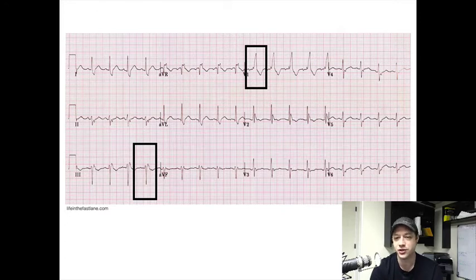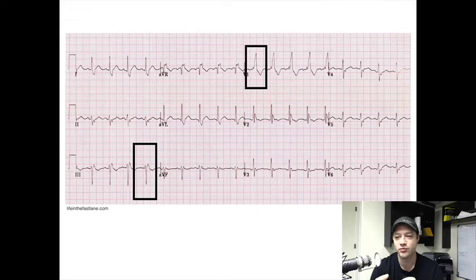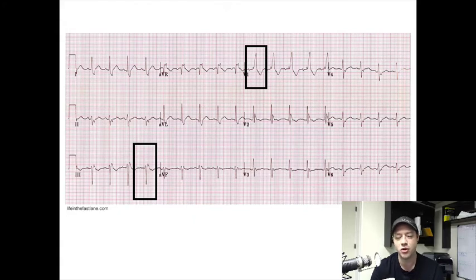As far as the fascicular blocks are concerned, that's part of the criteria for a bifascicular block. You see there are really small R waves in these QRS complexes and some rather large S waves, but they're not as proportionate as we want them to be. So we have this small R wave, a left axis deviation, a right bundle branch block — and that is what leads to a bifascicular block.